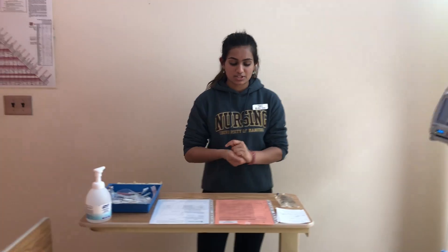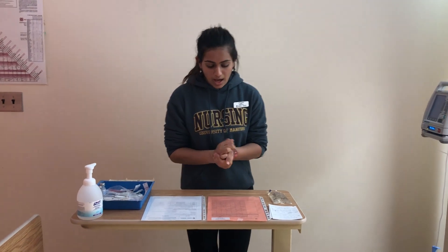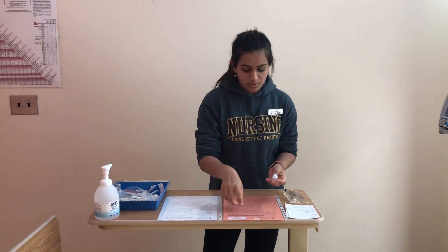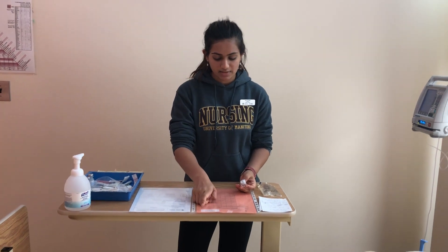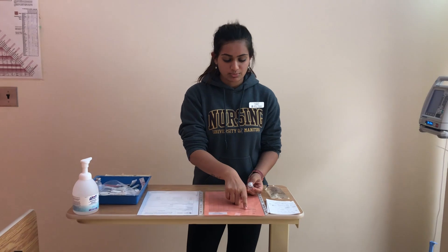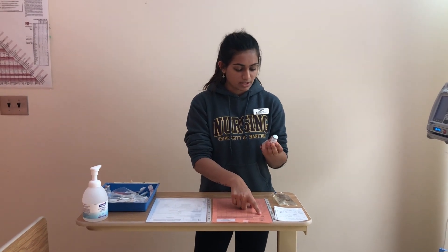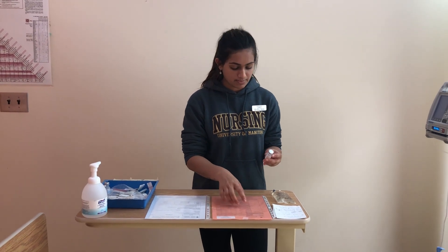Prior to beginning, I've already checked the physician's order with the MAR to ensure the information was transcribed correctly. I'm going to grab my vial from Pyxis. My patient is Emma Wrightson, 30 years old. It's for Dr. Nichols. Allergy to morphine, and she's going to be receiving methylprednisolone, also known as methylprednisolone sodium succinate. The reason she's receiving this medication is because she had acute exacerbation of asthma.